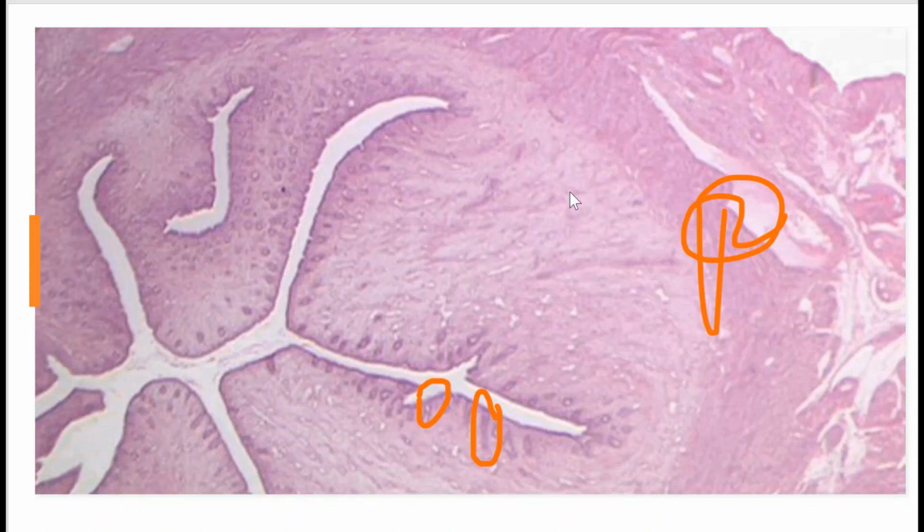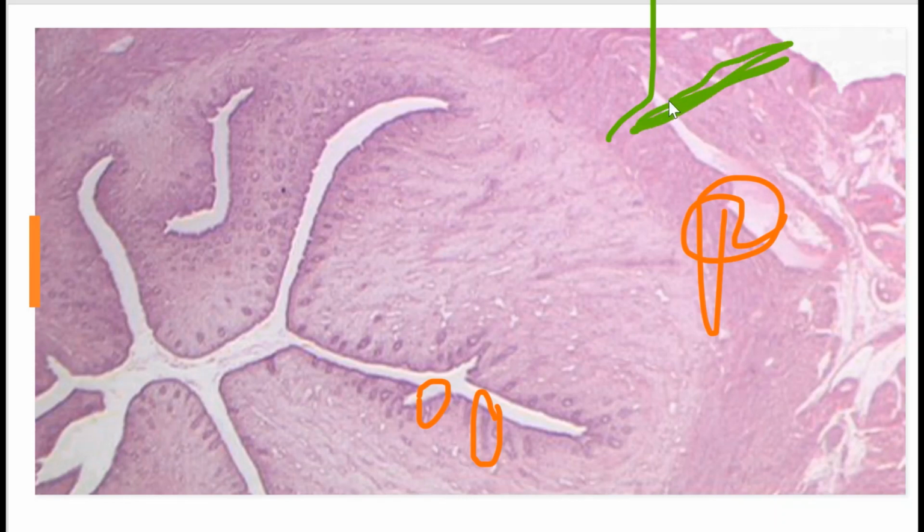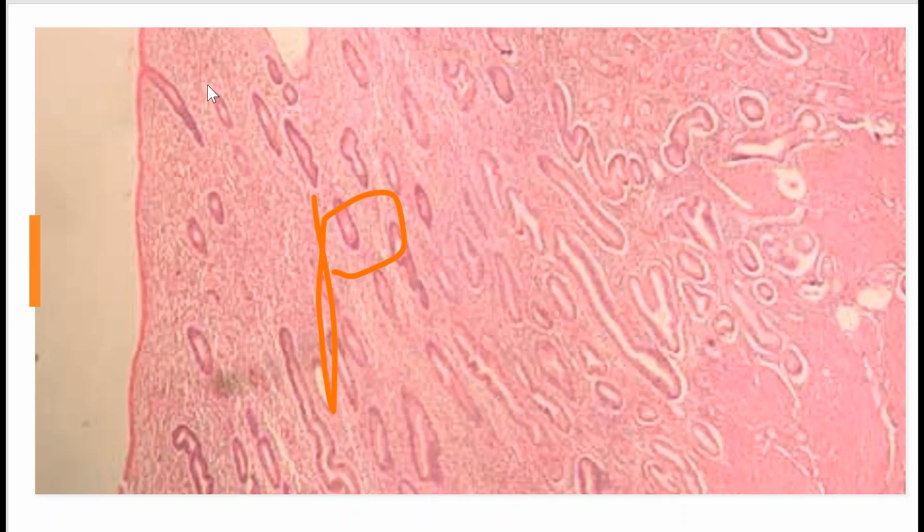If I were looking at this one, this is all myometrium. Okay, myometrium. This would be your stratum basalis here, and then your stratum functionalis up in here. I don't know. That's a hard one too. I didn't pick really great slides, y'all.